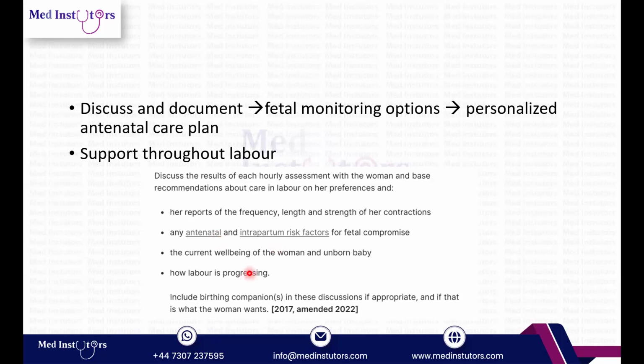You have to see the well-being of the mother. That means her vitals are to be checked as well as the fetal well-being taken into consideration, and how the labor is progressing. So the guideline time and again tells us that whatever we do, the CTG is not something that is to be done just as a diagnostic tool alone. It is to be done in conjunction with the mother's and the fetal condition. Correct? So you have to look at the whole clinical picture.